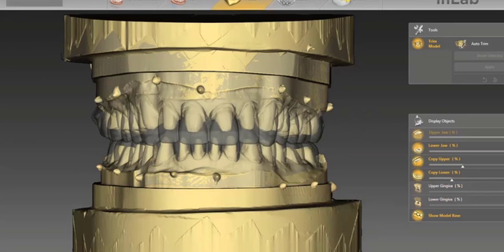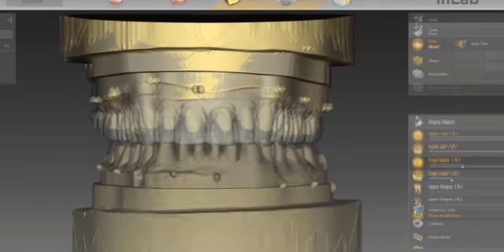In other words, if teeth are splayed out distally and you want to have nice mesial inclinations to your teeth, it's going to be very challenging in the laboratory to try and achieve that. But this to me is the perfect case where each prep is lined up perfectly within the outline of the desired result of the temps that the patient's living and functioning with. So this is like my dream in my lab. These are the kinds of cases I love doing.